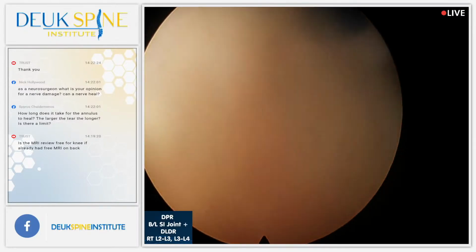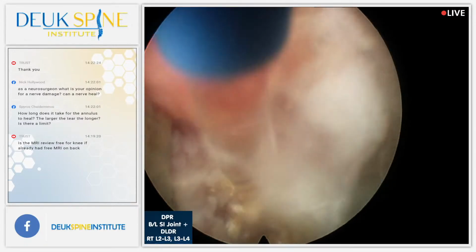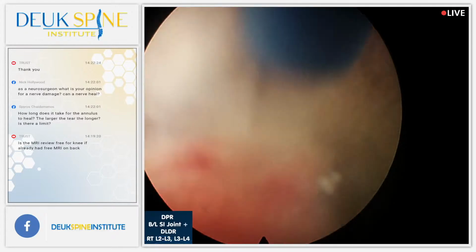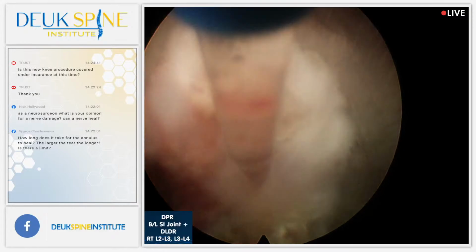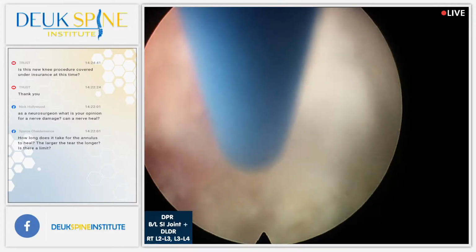All right. This is the farthest back part of the disc. This is where we had all the problem getting into. You can see all the calcium. There's a little bit of fat there, but this is the last 3 minutes, doctor. 3 minutes.